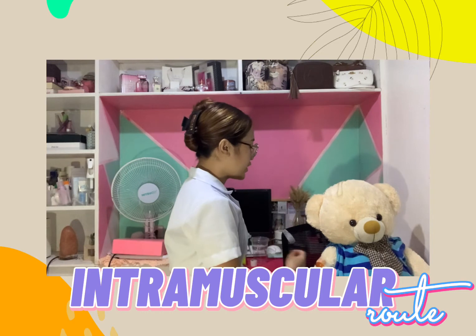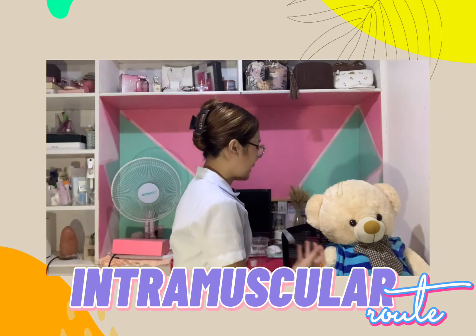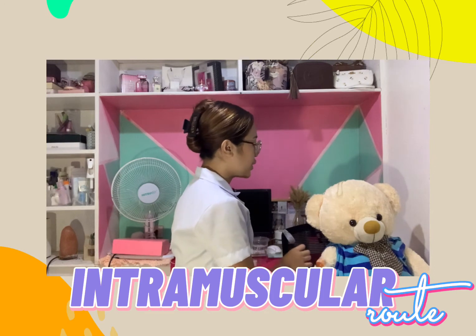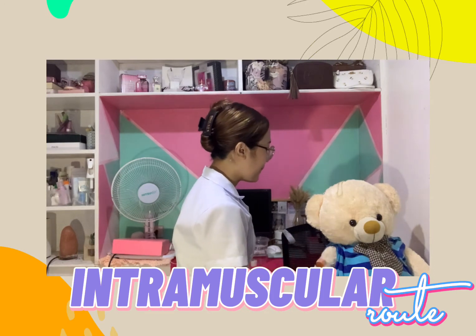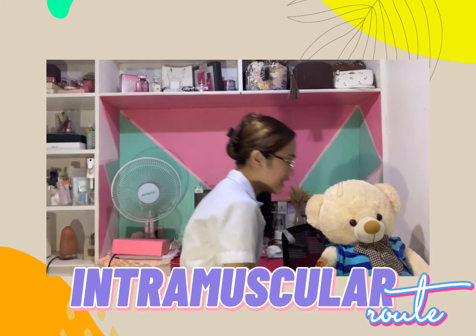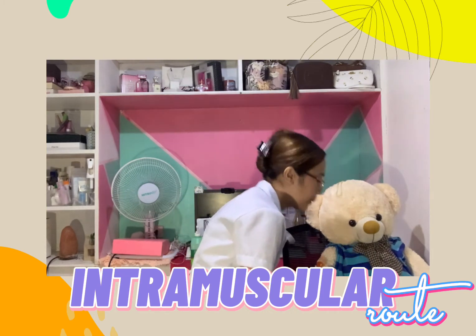Later, discomfort will be felt on the site where we will administer the medication. Tell us when you can't handle the pain, and make sure to relax your arm for you to cooperate. Is that okay with you, ma'am? Okay.